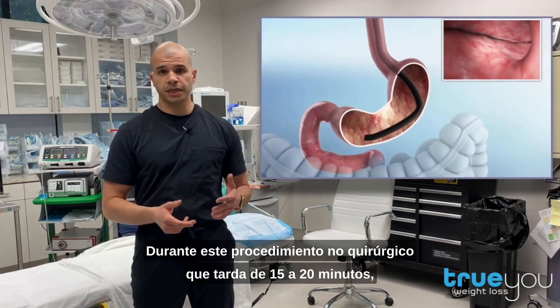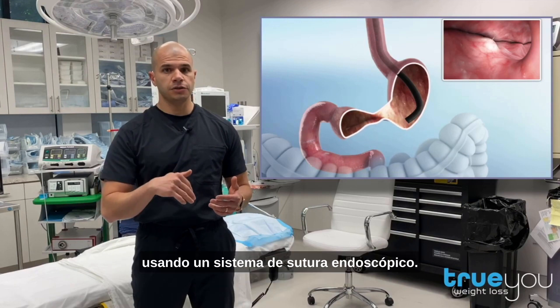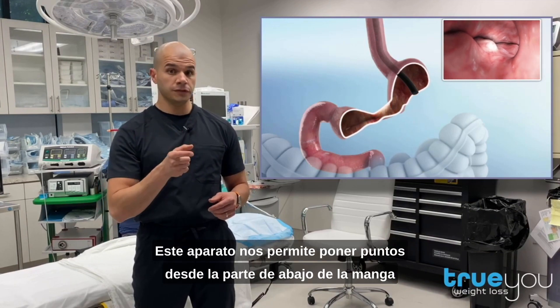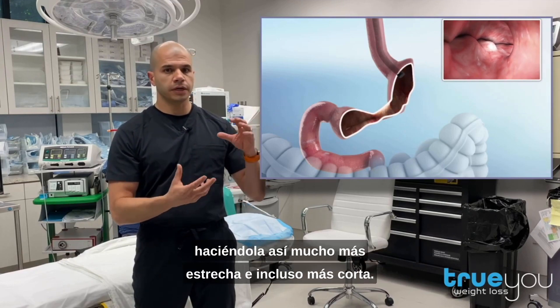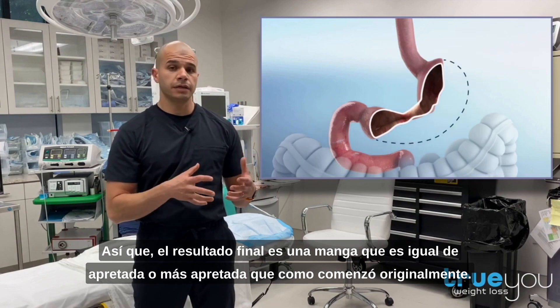During this 15 to 20-minute non-surgical procedure, we are able to tighten the stomach from the inside using an endoscopic suturing system. This device allows us to place stitches from the bottom of the sleeve to the top of the sleeve, thereby making it much narrower and even shorter. The end result is a sleeve that is as tight or tighter than it originally began.